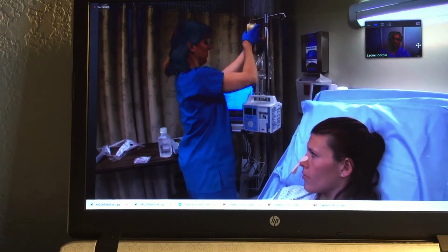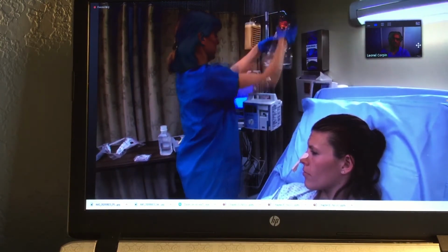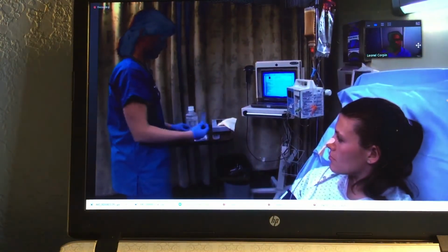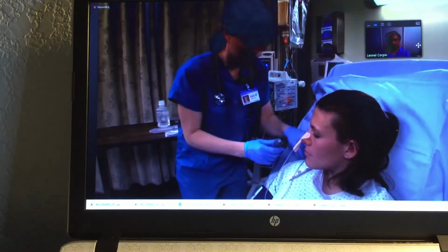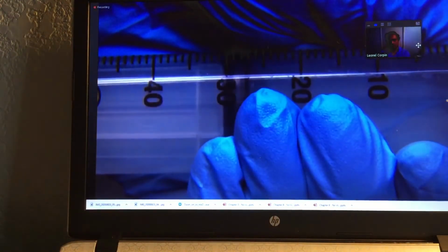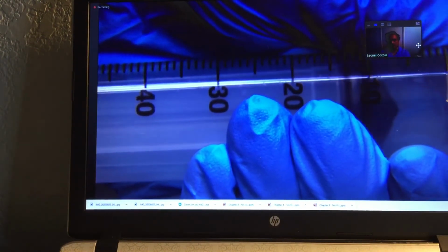Verify tube placement by using at least 2 methods after initial verification by an abdominal X-ray. Confirm the length of the tube at the point of entrance with the order and documentation to make sure the tube has not dislodged. Inject 30 milliliters of air into the tube to clear it of formula, medication, or flush solution.